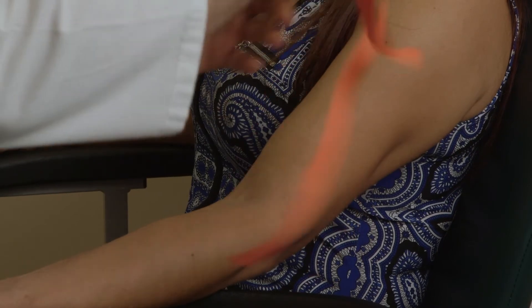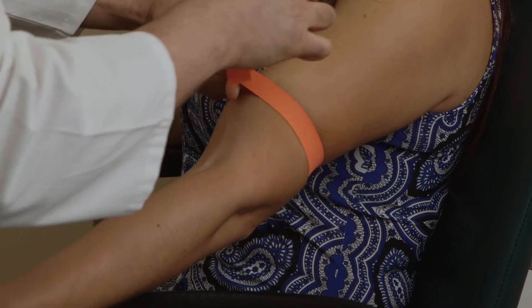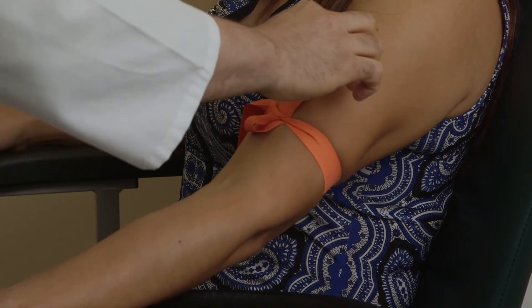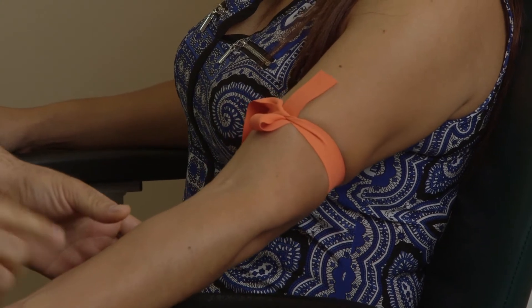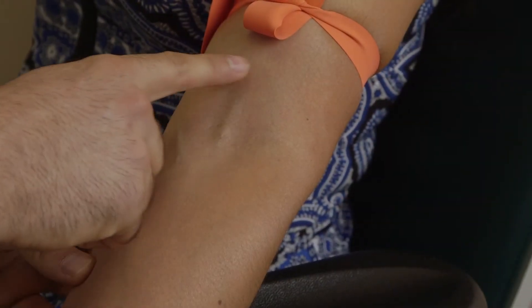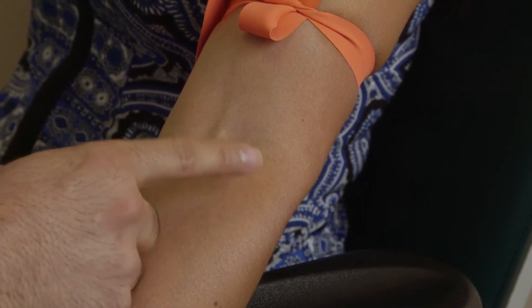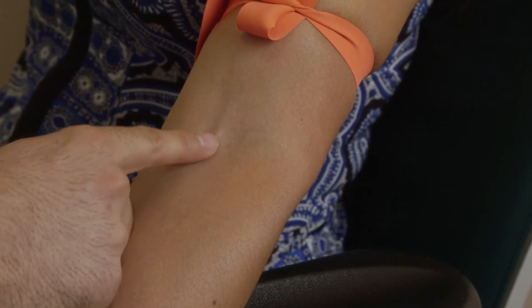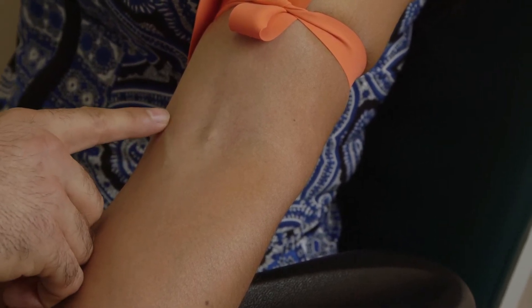I'm going to grab the tourniquet. We always put it dog ears, never frog legs going up, so that when we have to release it, it will be one swift motion. Next, I will tell her to make a fist, and this will make the veins pop out more. This area is called the antecubital space. We have three main veins to choose from: the outermost, which is the cephalic; the middle, which is the preferred choice, called the medial cubital; and the innermost, which is the basilic vein.